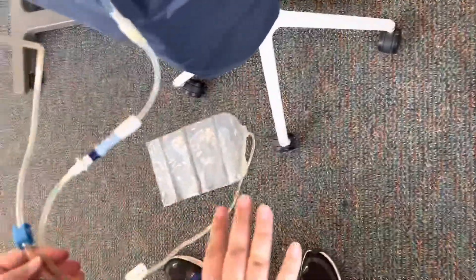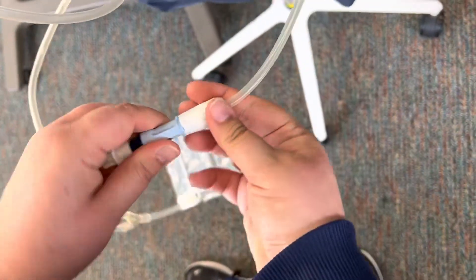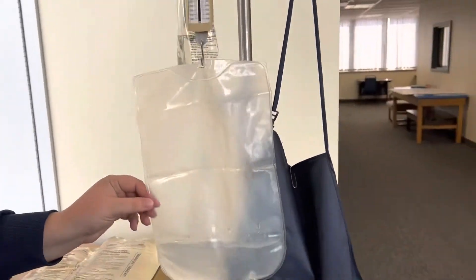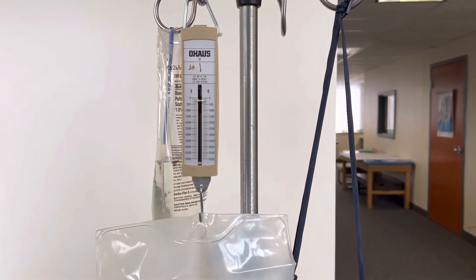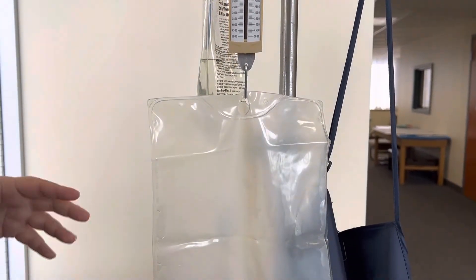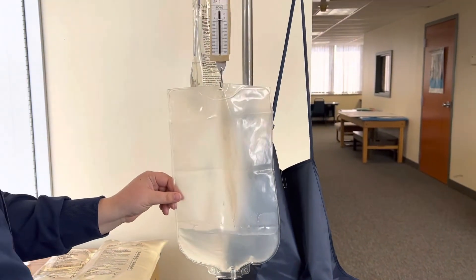Once this is all completed, we're going to clamp our tubing and close the transfer set back up. Before we fill that abdomen again, I want to weigh the amount of solution in the bag — whatever is showing should be equal to the amount that was placed into that abdomen before you drained it.